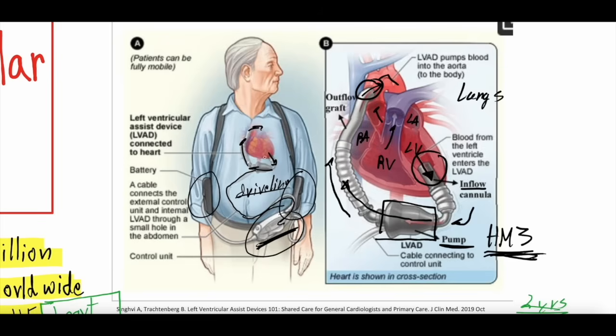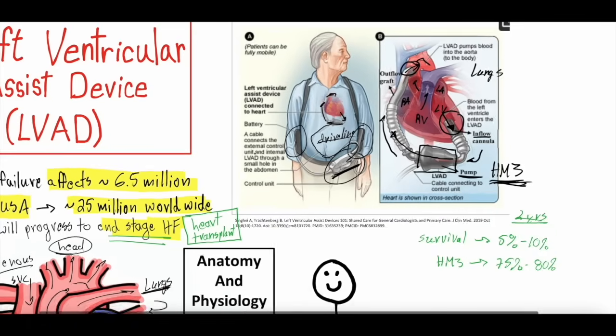So you can see that people with LVADs walk around with all these things, but compared to just taking medical therapy and not surviving, this is, in many people's minds, a big upgrade. Certainly it's patient dependent. Obviously everyone has different preferences for how they're willing to live, but that's what the general structure looks like for people who have an LVAD and are out in the world.